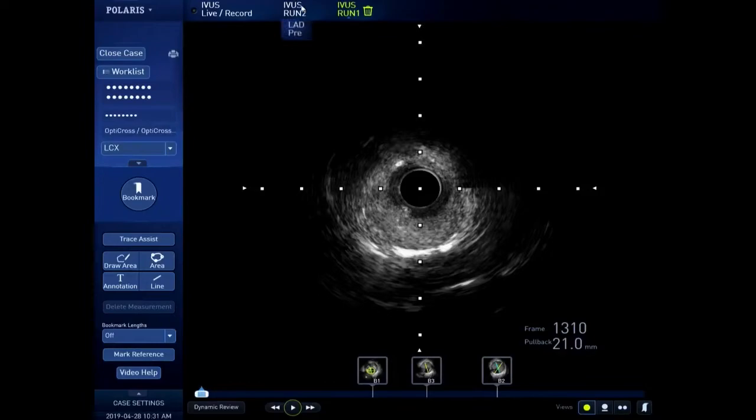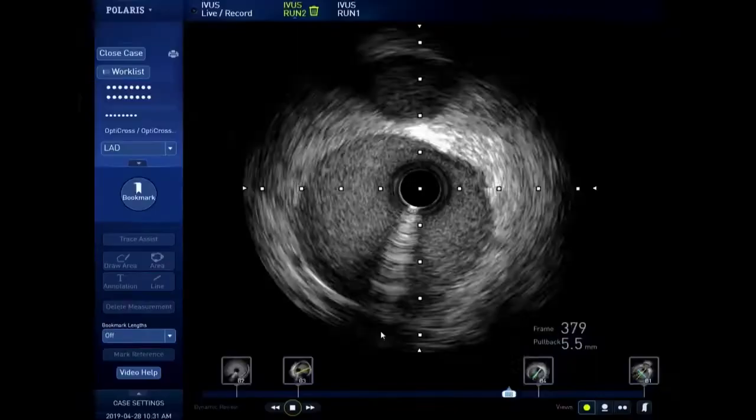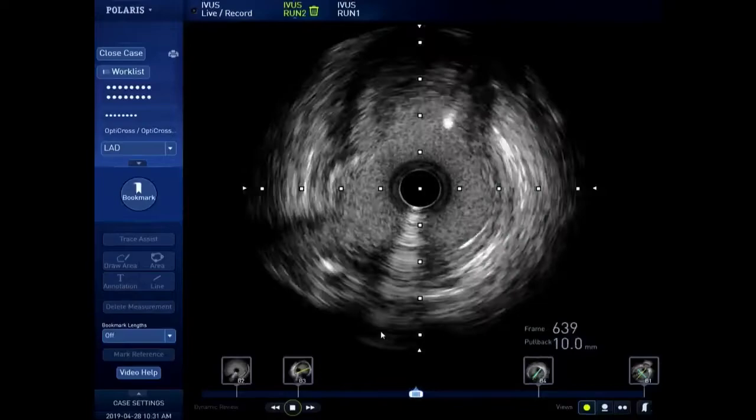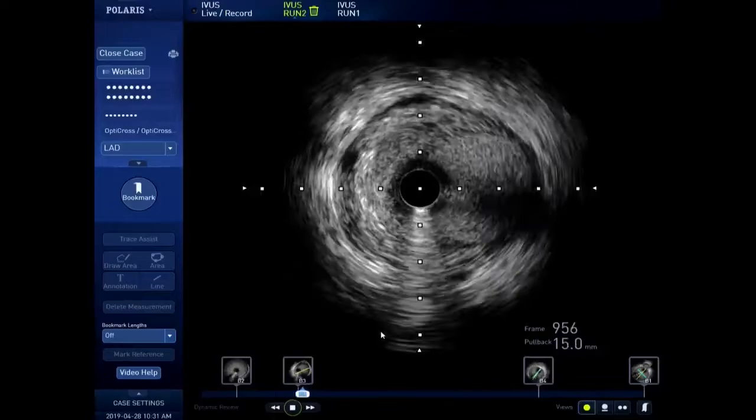Could you show us the proximal LAD to the left main? This is the proximal LAD, and the vessel size is also 4.0, and there is no disease, and this is the circumflex coming. So the LAD ostium is okay, but the disease just involved the distal left main, and we should definitely cover the LAD ostium. This is the distal left main.